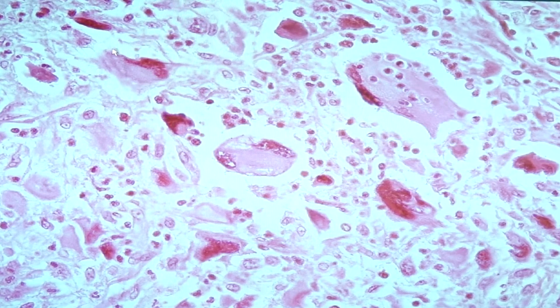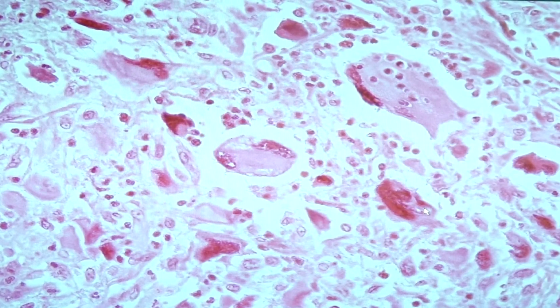When you say bizarre nuclear features, you have large nuclei with irregular nuclear membrane, multinucleation, hyperchromatic nuclei, and a very large cell body with eosinophilic cytoplasm, which is very characteristic for rhabdomyosarcoma. This would be positive for myogenin. Of course, vimentin would also be positive in this case.